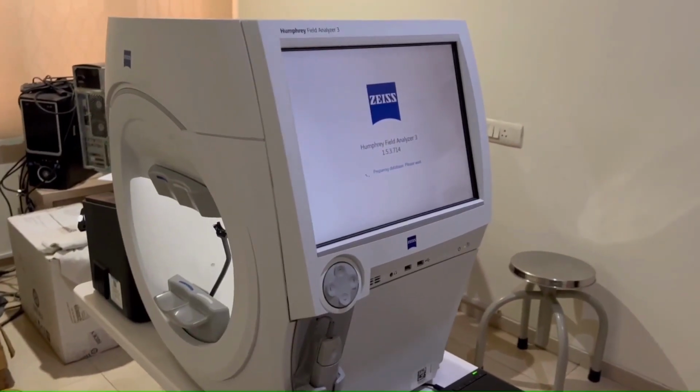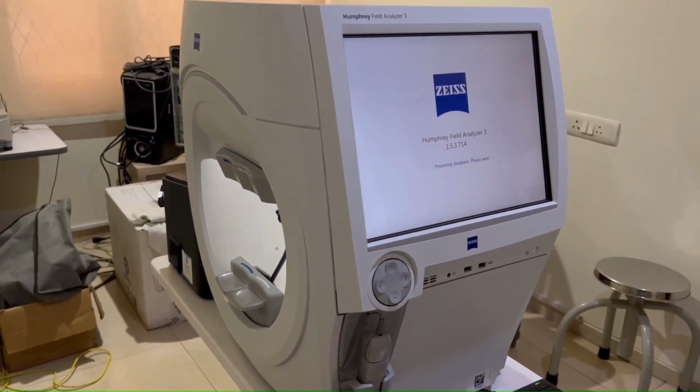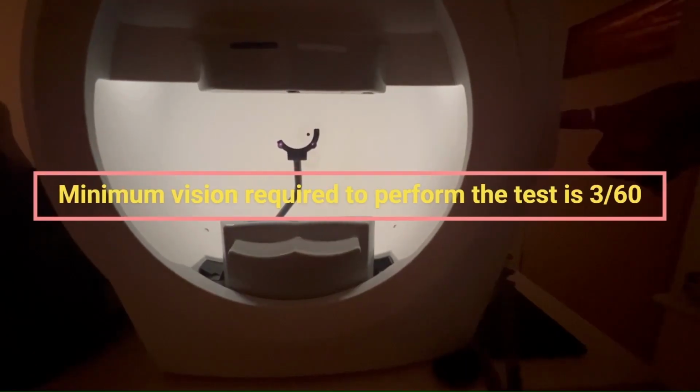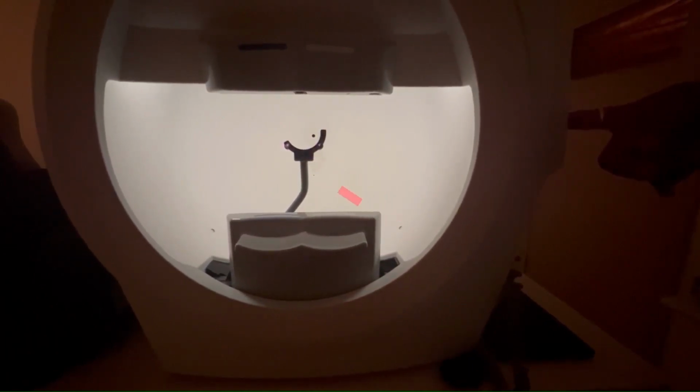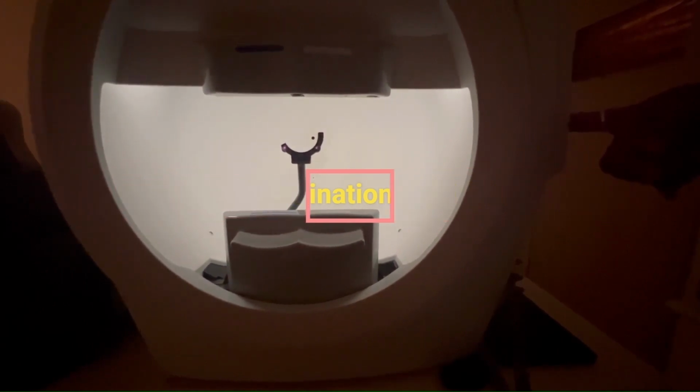Humphrey field analyzer is an automated perimeter intended to identify visual field defects. The purpose of this video is to provide procedure instructions useful for operating the instrument and testing the patient while monitoring the screen.